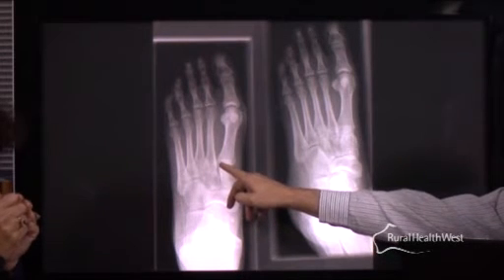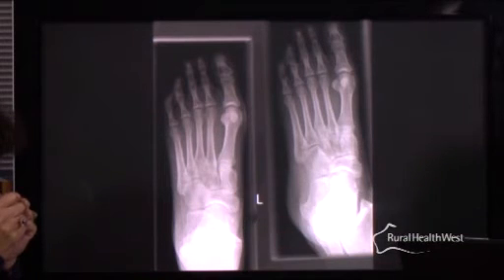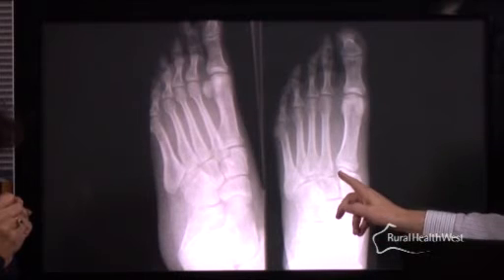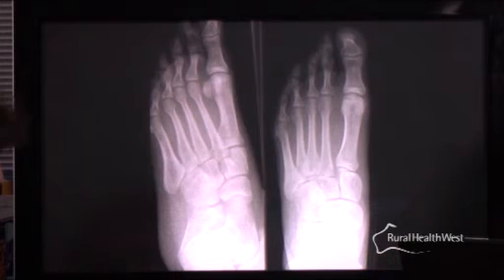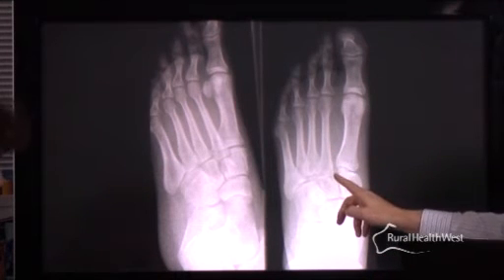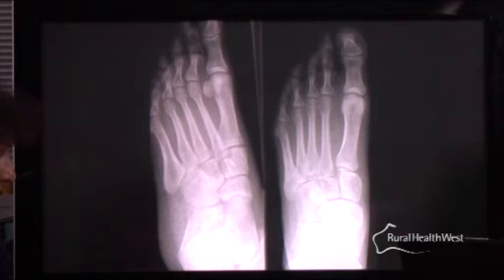The space between the medial cuneiform and the base of the second metatarsal is usually 2 millimetres or less, so it's a fairly narrow space. But when you disrupt the Lisfranc ligament, there is a step-off which occurs, and you can see that the space is now widened beyond 2 millimetres, and that cortical margin doesn't align with the cortical margin of the cuneiform. And unlike the other metatarsals where there are ligaments which run transversely, there is no transverse ligament there, so it's a potential point of weakness. And it doesn't look that bad.